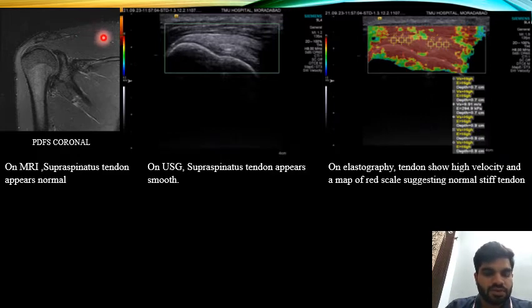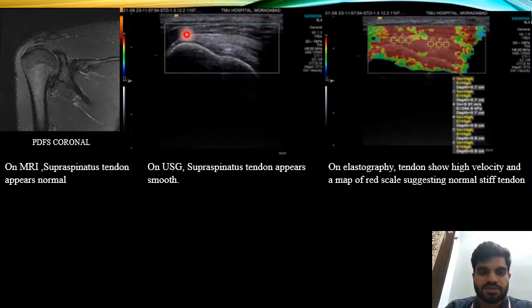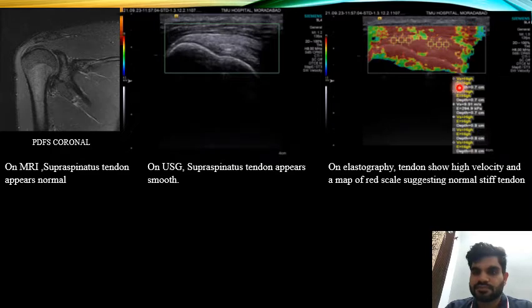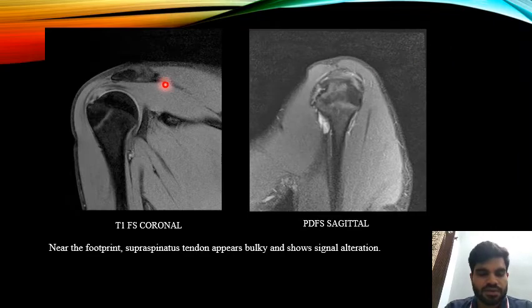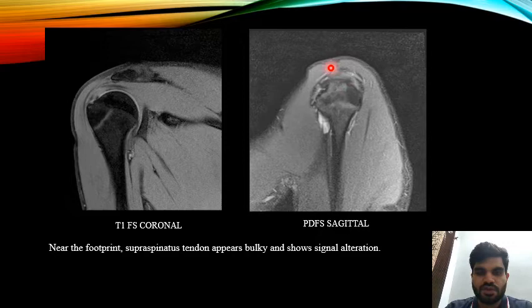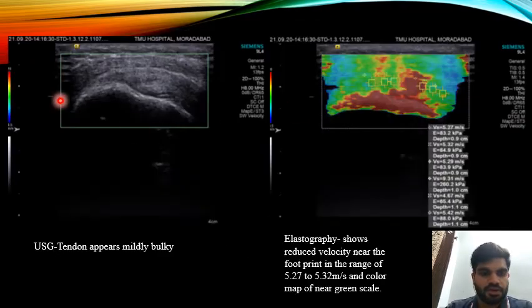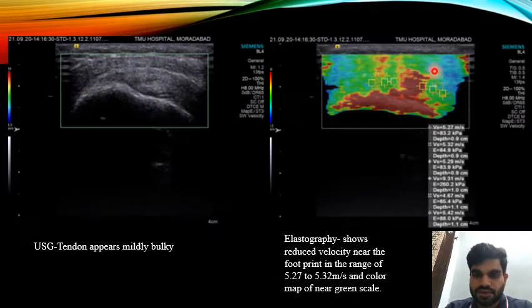This MRI image shows the normal supraspinatus tendon. On ultrasound, the supraspinatus tendon appears smooth. On elastography, the tendon shows high velocity and a map of red scales, suggesting a normal stiff tendon. In this case, near the footprint, the supraspinatus tendon appears bulky with signal alteration on T1 fat-saturated coronal and PD fat-saturated sagittal images. On ultrasound the tendon appears mildly bulky, and on elastography it shows reduced velocity near the footprint in the range of 5.27 to 5.32 m/s with a color map of near green scale.